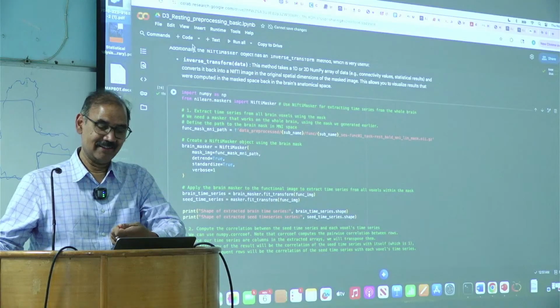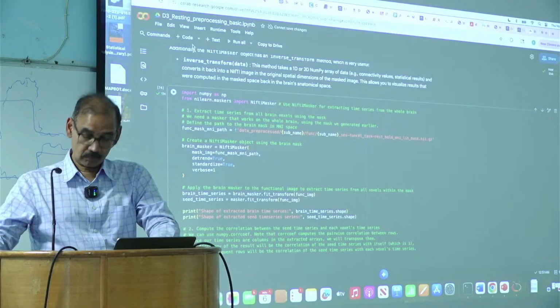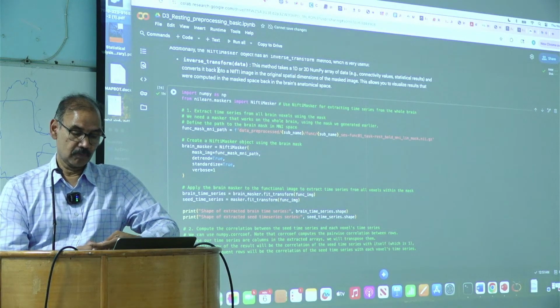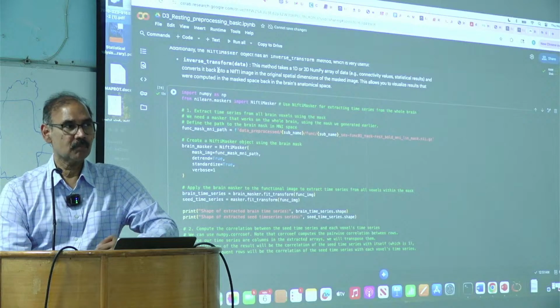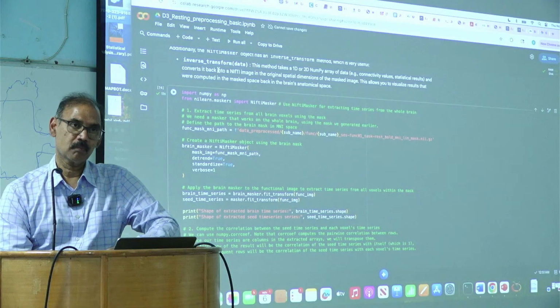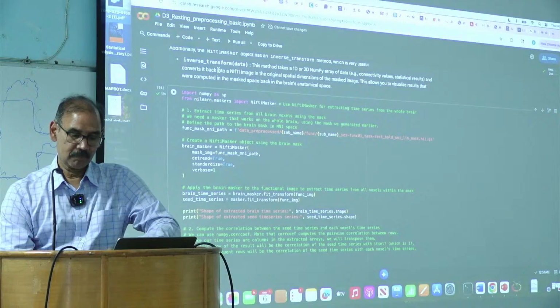If you're doing the task, let's say you're saying tap your left hand, in the functional data there will be other variables also input, so the activations will be coming not just from the task but from other factors as well. In the resting state, the functional activity which was happening, let's say in the motor region because of the finger tapping, will be continued and sustained. So rather than getting activity from all of the factors, including the motor response, you'll be getting only the motor response. So it's more, let's say, pure.